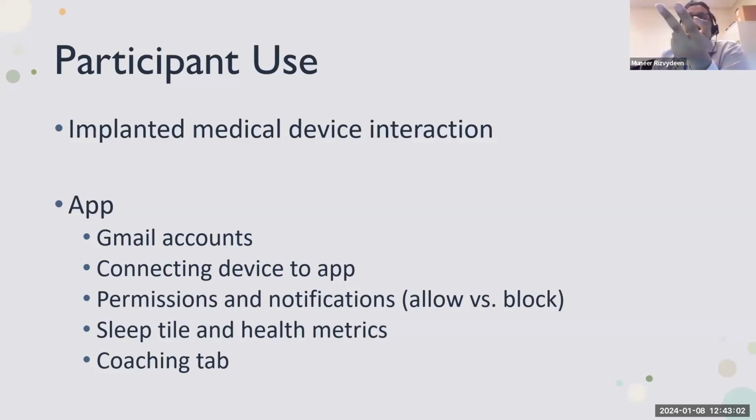We block the irregular heart notifications, the sort of warning message. We do not give the Fitbit access to location or GPS. The only notifications we allow are the low battery notifications, and we allow these both as push notifications and email notifications. Basically, if the Fitbit drops below 25%, they get a little message saying they need to charge their device.